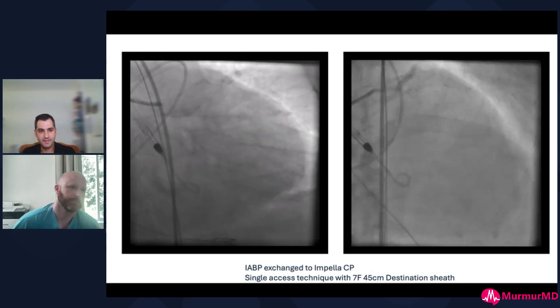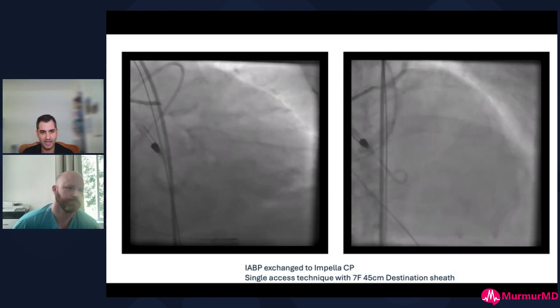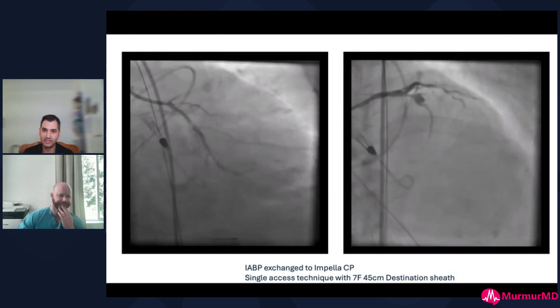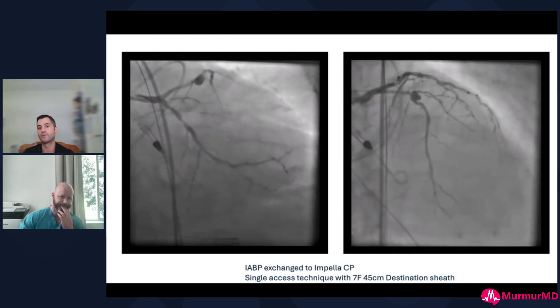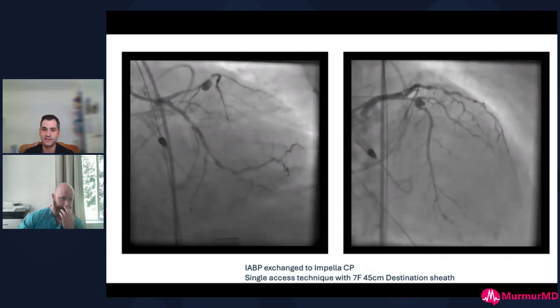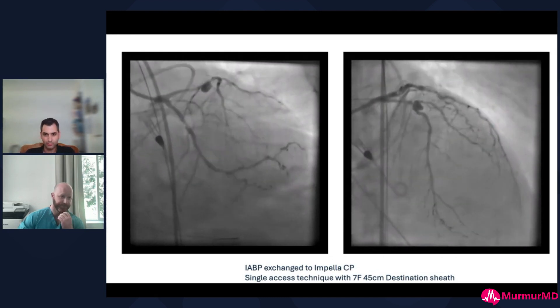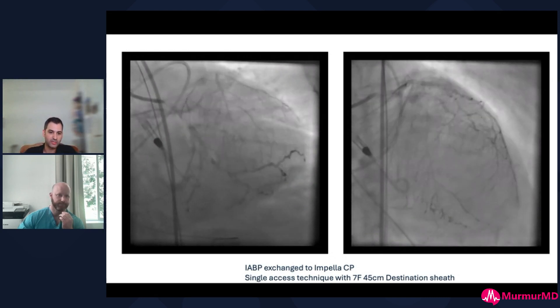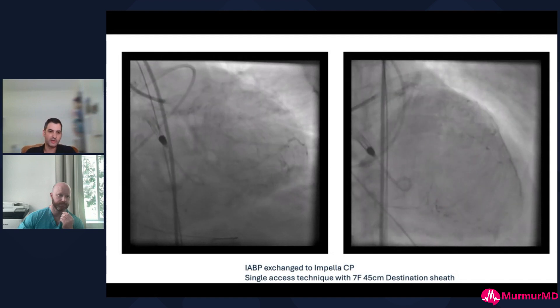The right coronary is total. The circumflex has severe calcium, multifocal disease, and is very tight proximally. The LAD has a gnarly aneurysm and a lot of calcium there. Honestly, before I started the case I probably underappreciated that — when you have such a big aneurysm and other findings, you can get a little distracted and not appreciate just how calcified it was.